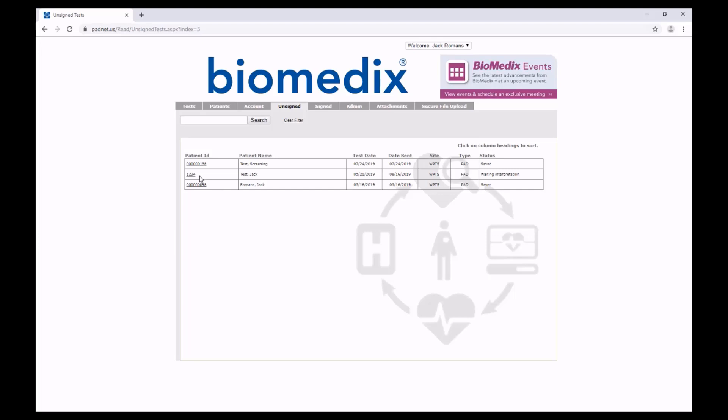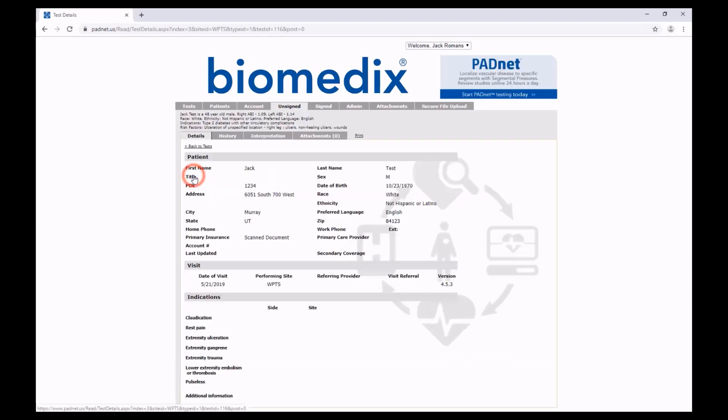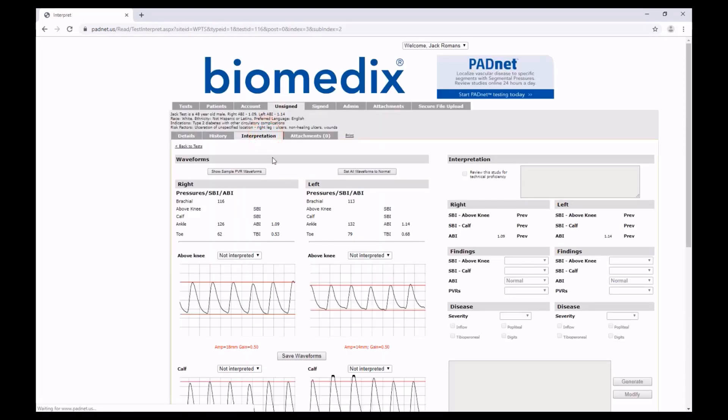To start, we're going to click on the Patient ID to open the test, and go to the Interpretation tab.